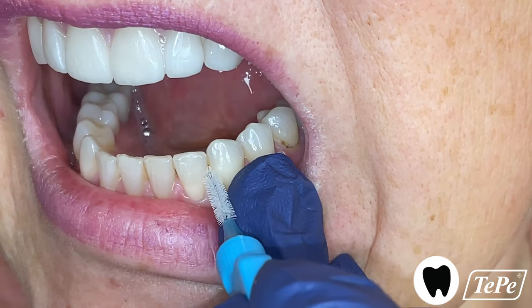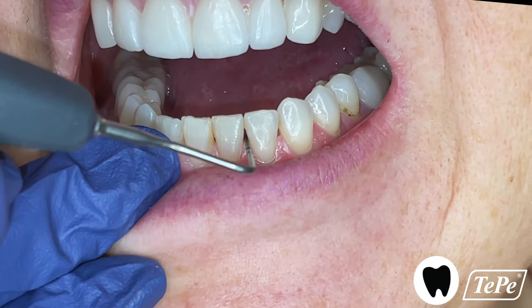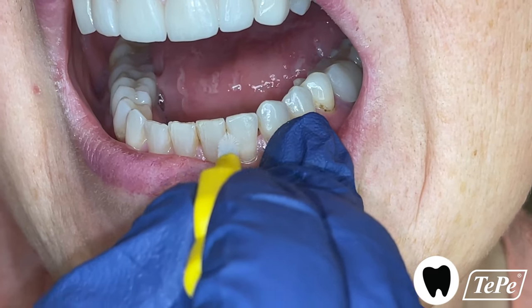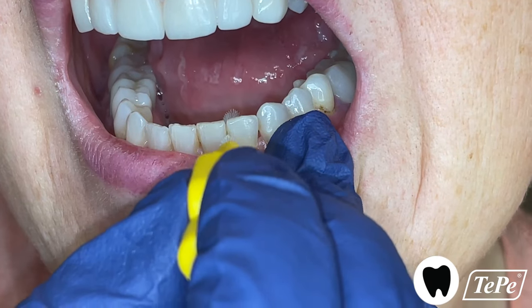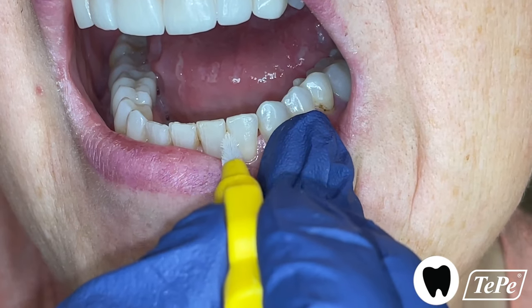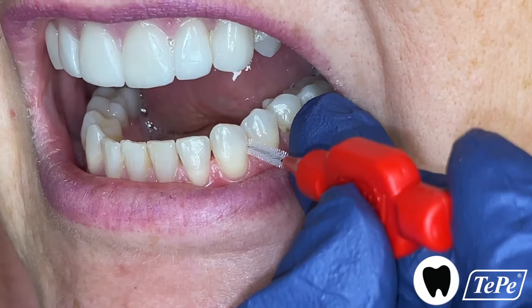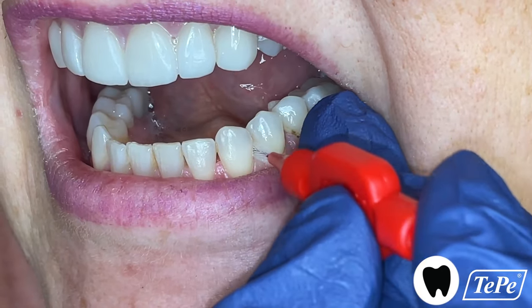However, in this area close by, I can pass the probe right through the space without touching either tooth. So I'll have the patient use the next size up, a yellow one, here. Have the patient pass it back and forth gently in the area a few times to remove the biofilm. Now the space next door is a bit more narrow than the probe, so downsize here to the smaller red brush.